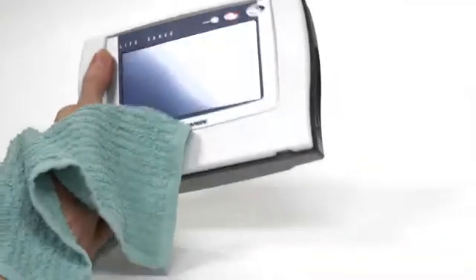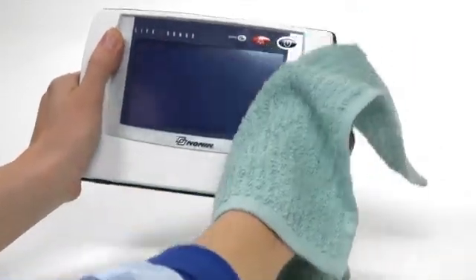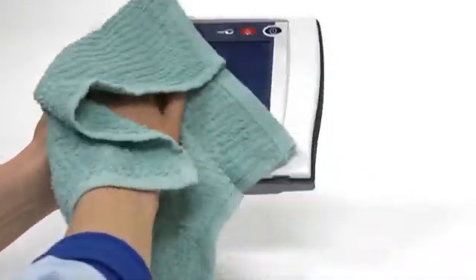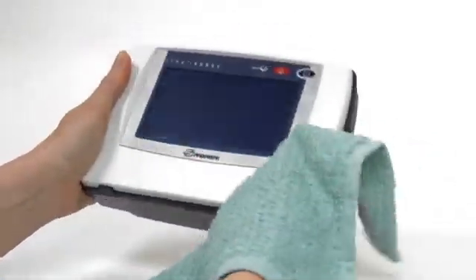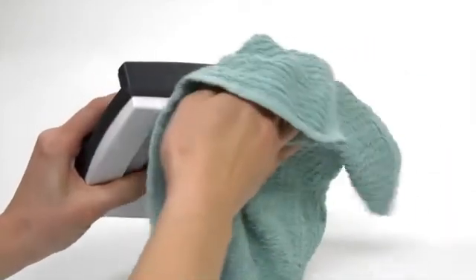Following use, you can clean the monitor with a soft cloth moistened with isopropyl alcohol. Allow the monitor to dry completely before use.